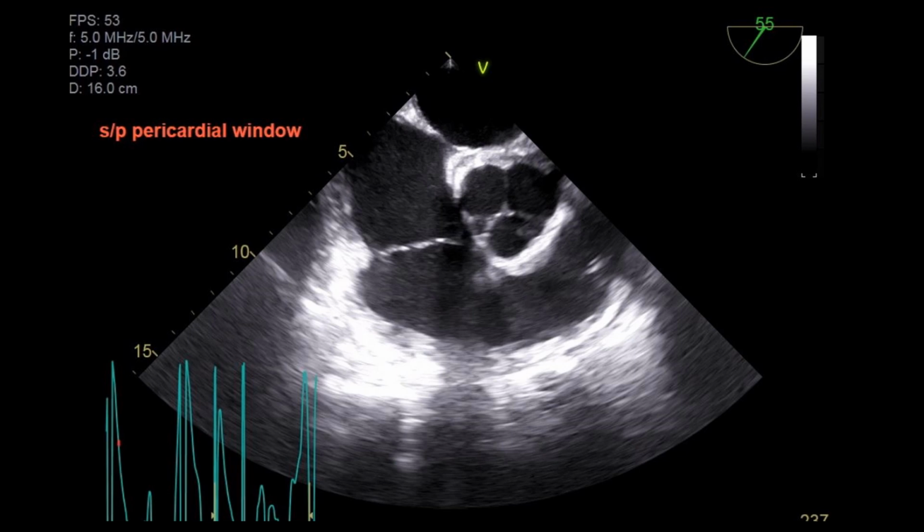That non-coronary cusp is going to be associated with your interatrial septum. So that's your interatrial septum, and then your non-coronary cusp is right there. We already talked about this chamber down here being the right ventricle, and as our right ventricle is supplied by the right coronary artery, this is our right coronary cusp. This allows our remaining coronary cusp to be the left coronary cusp. And with the left coronary cusp, we can see something that's kind of coming off distal to it right here, and that is going to be your left main coronary artery.